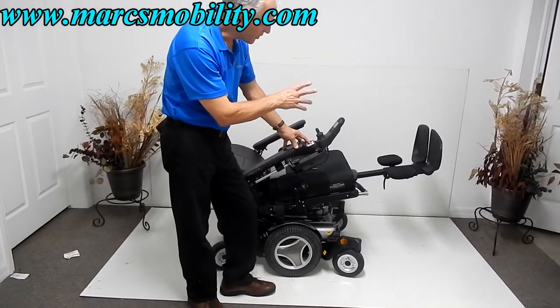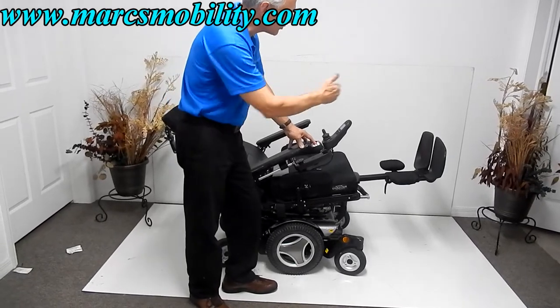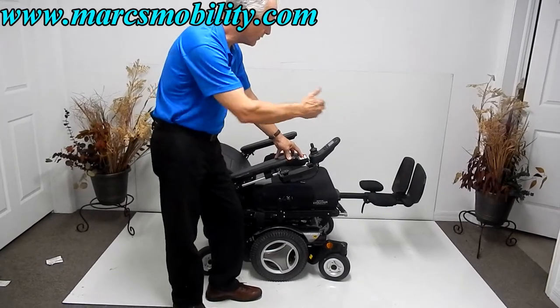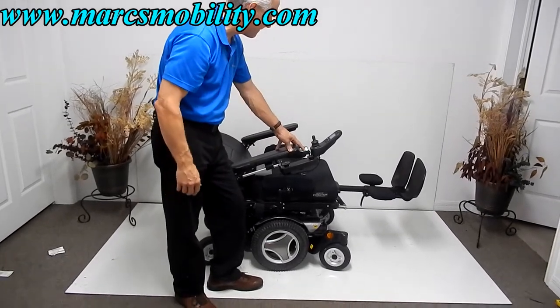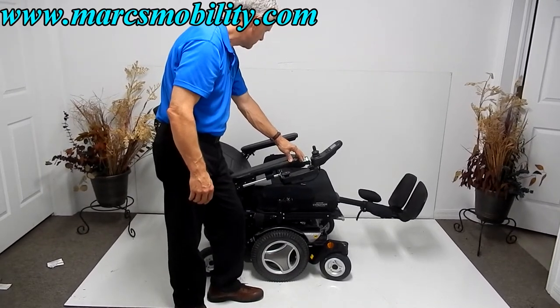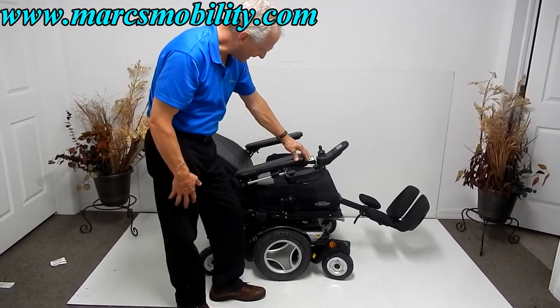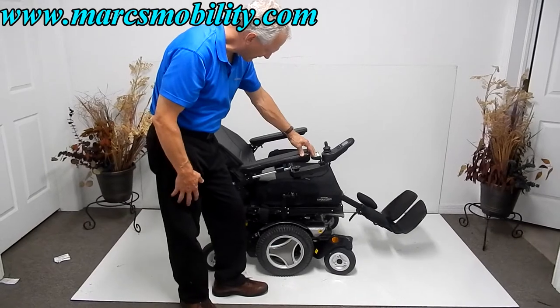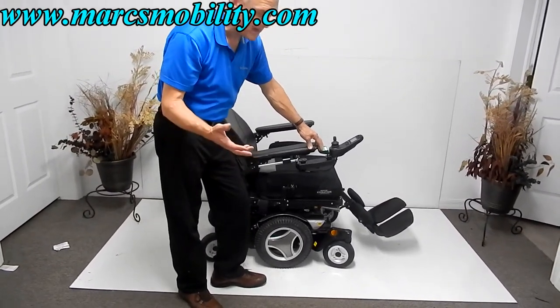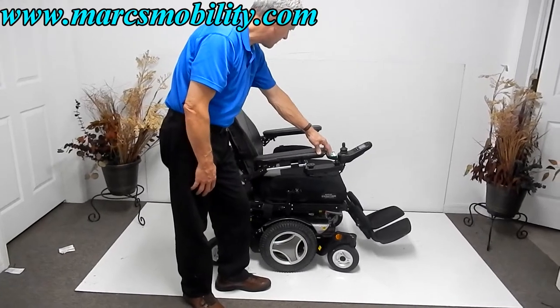These foot plates are adjustable — we can make them longer or shorter depending on your height. We can adjust those manually; they're still going to be electric, but we can adjust the length of them. Now I'm going to bring the legs back down and the seat back up. This chair has 13 miles, so it's literally almost brand new.